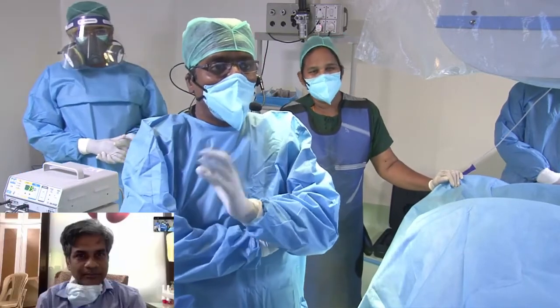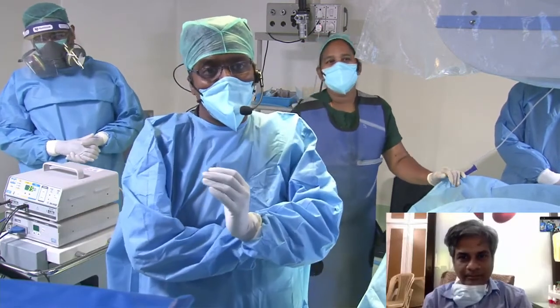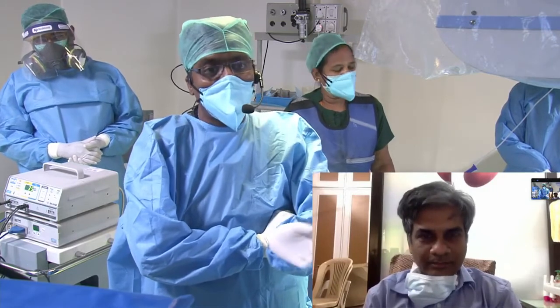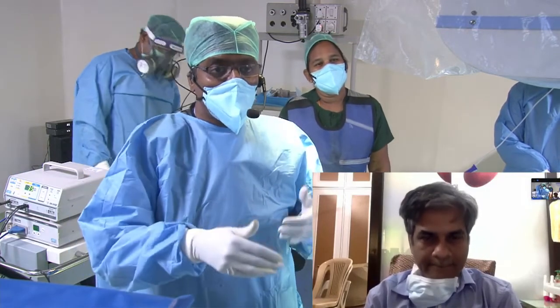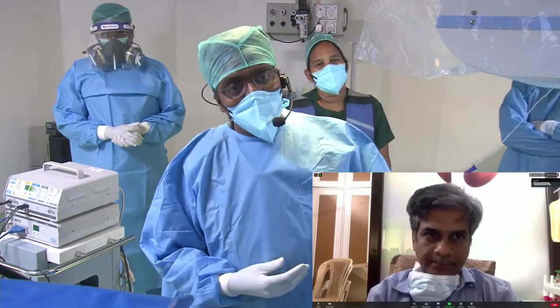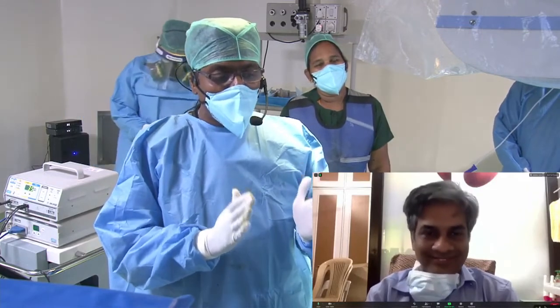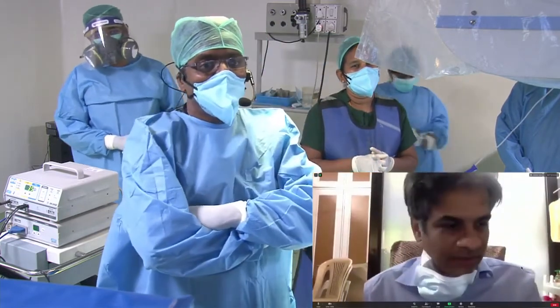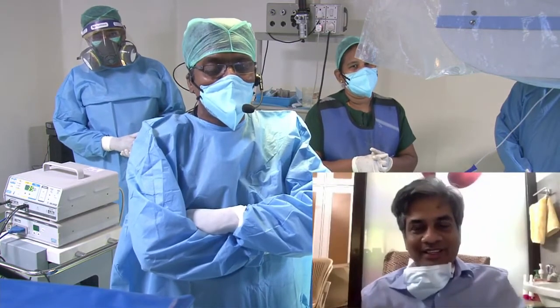That is the only way we can do intraoperative ERCP. I told you, there is a situation wherein it is going to be a little technically difficult. Cystic duct cannulation, put the cannula there, then I take the scope and do the procedure, or my colleague who is another surgeon can do it. Then we can continue with the lap chole. That is the laparoscopic rendezvous procedure, right? I was trained in that technique by a surgeon called Duluc from Bordeaux in France, and that is what we used to practice.